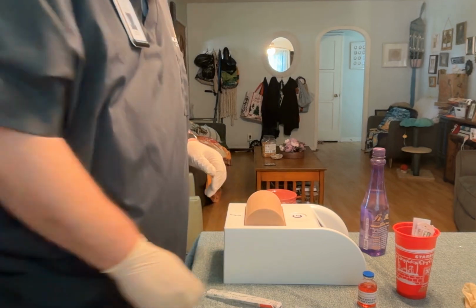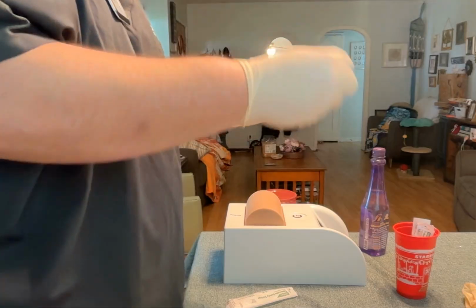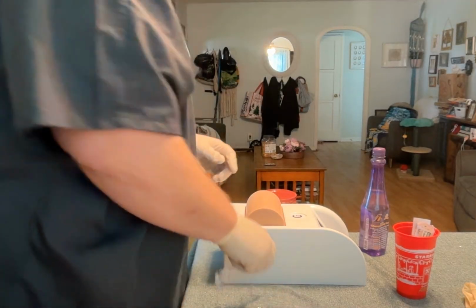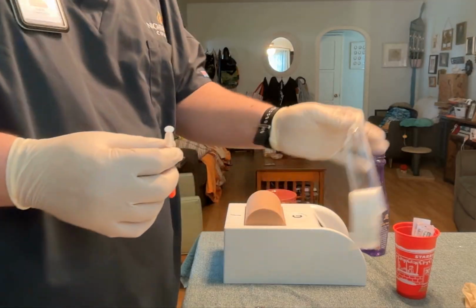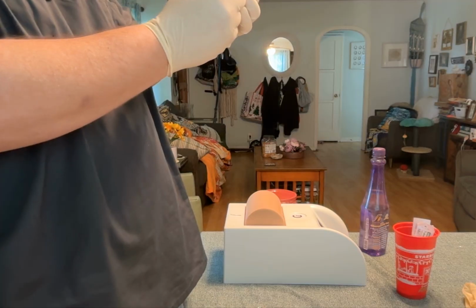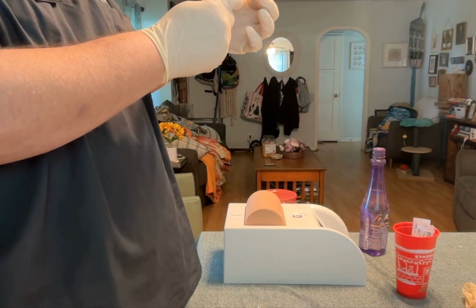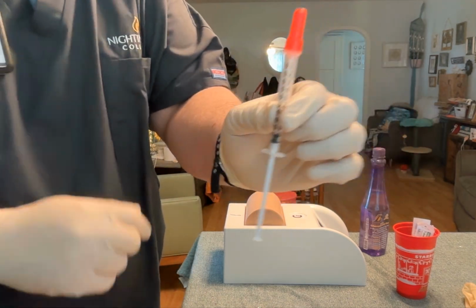So I'm going to take my heparin. I'm going to take an alcohol pad and clean the top of it. I'm going to let it air dry. While that's air drying, I'm going to open up my needle and discard the trash. I'm going to pull back my plunger and take it to 1 milliliter, which is down here. I have 1 milliliter of air.